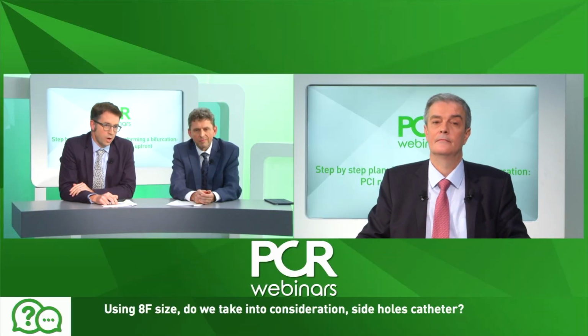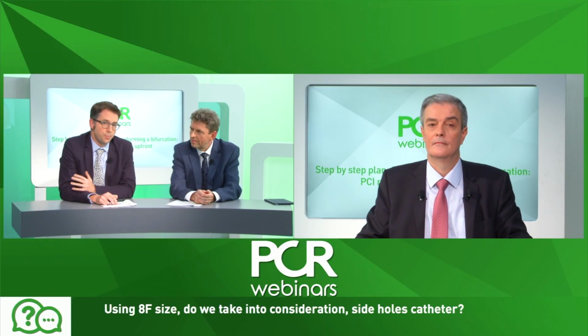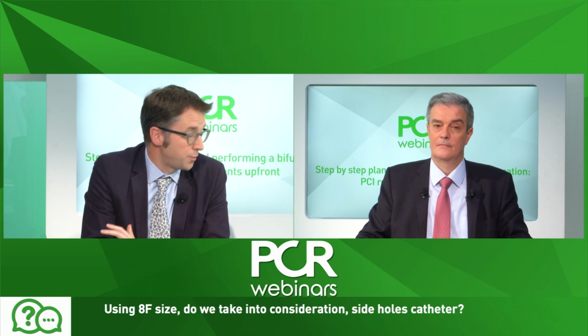Yeah, thanks. I think it was really excellent. We have a couple of technical questions. Using 8 French size, do we take into consideration side holes catheter? Nope. I wouldn't be looking to use side holes simply because I think it gives you a false reassurance.